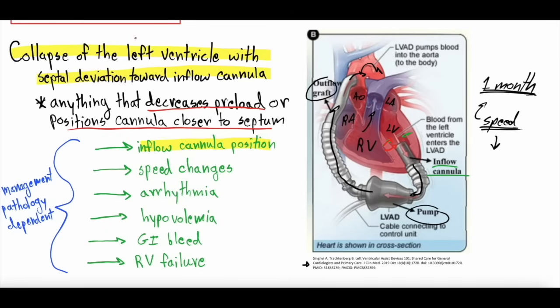Now, if someone has had their LVAD for months and months and they haven't had suction events and all of a sudden start having suction events, that's not going to be inflow cannula position, because unless that LVAD has moved around, which is not likely, this usually is something that happens right after implant of the LVAD.